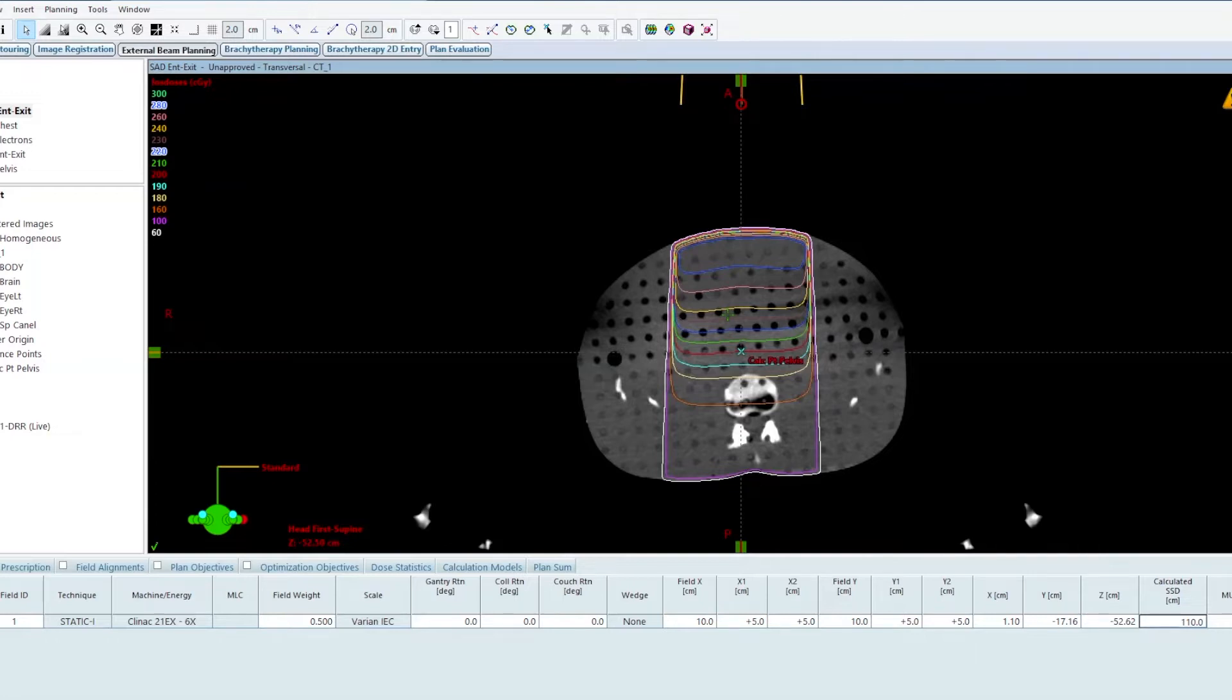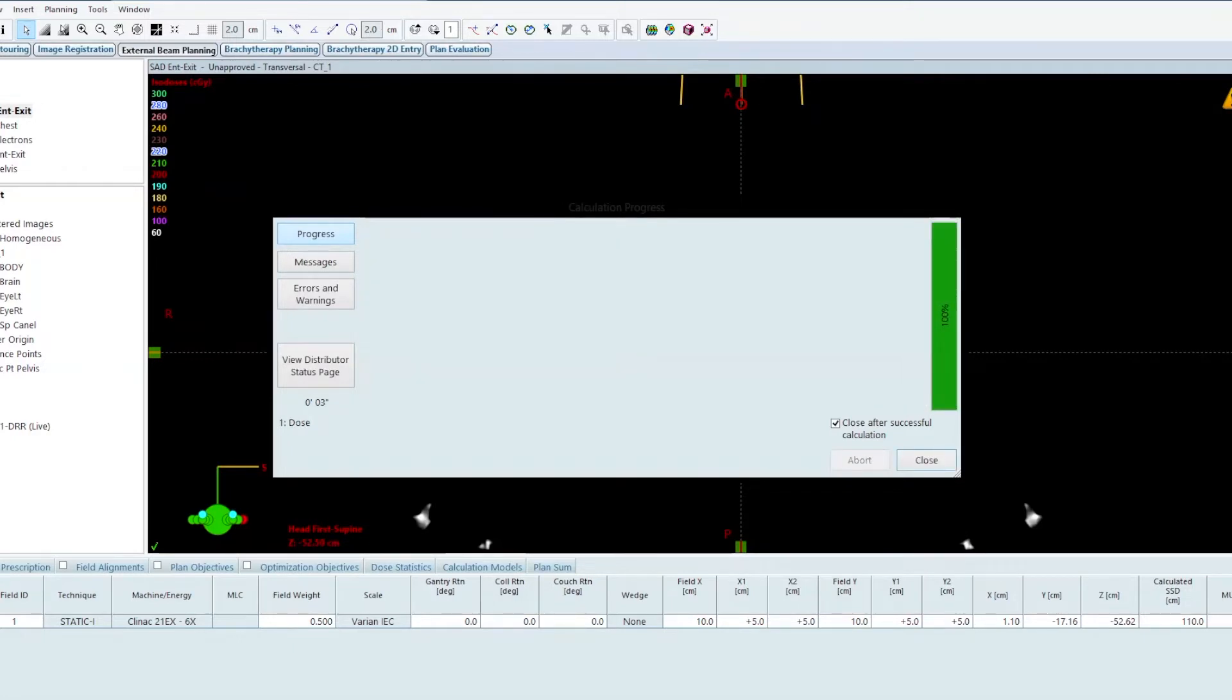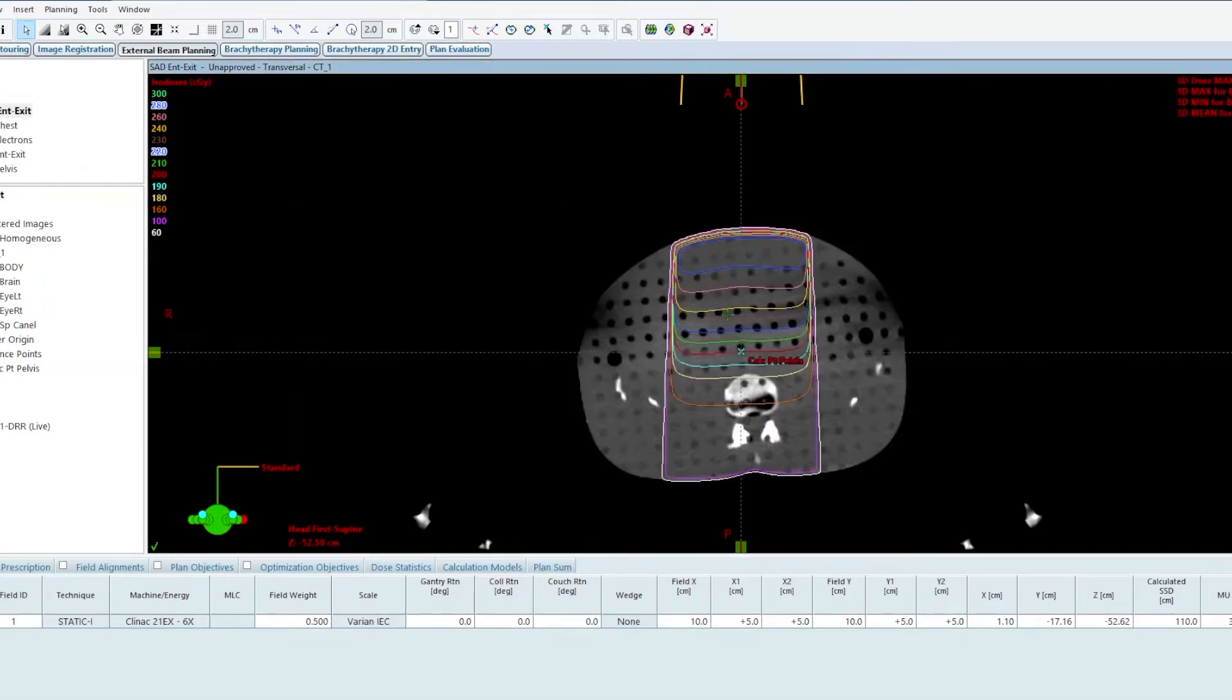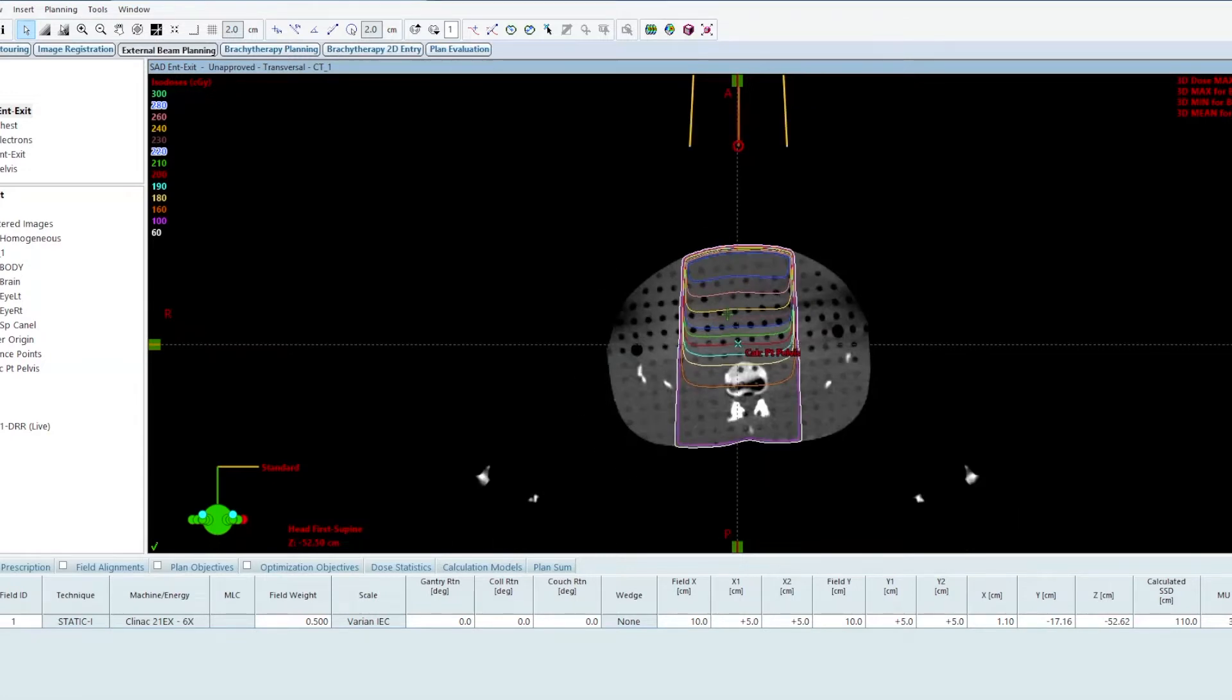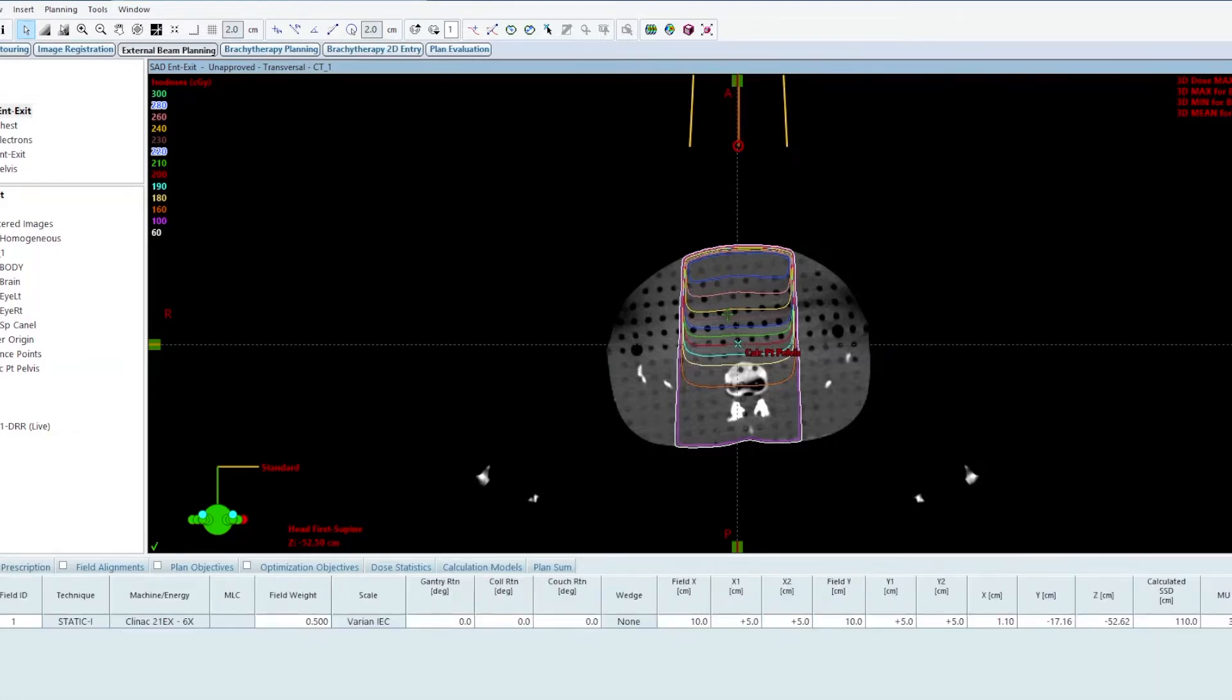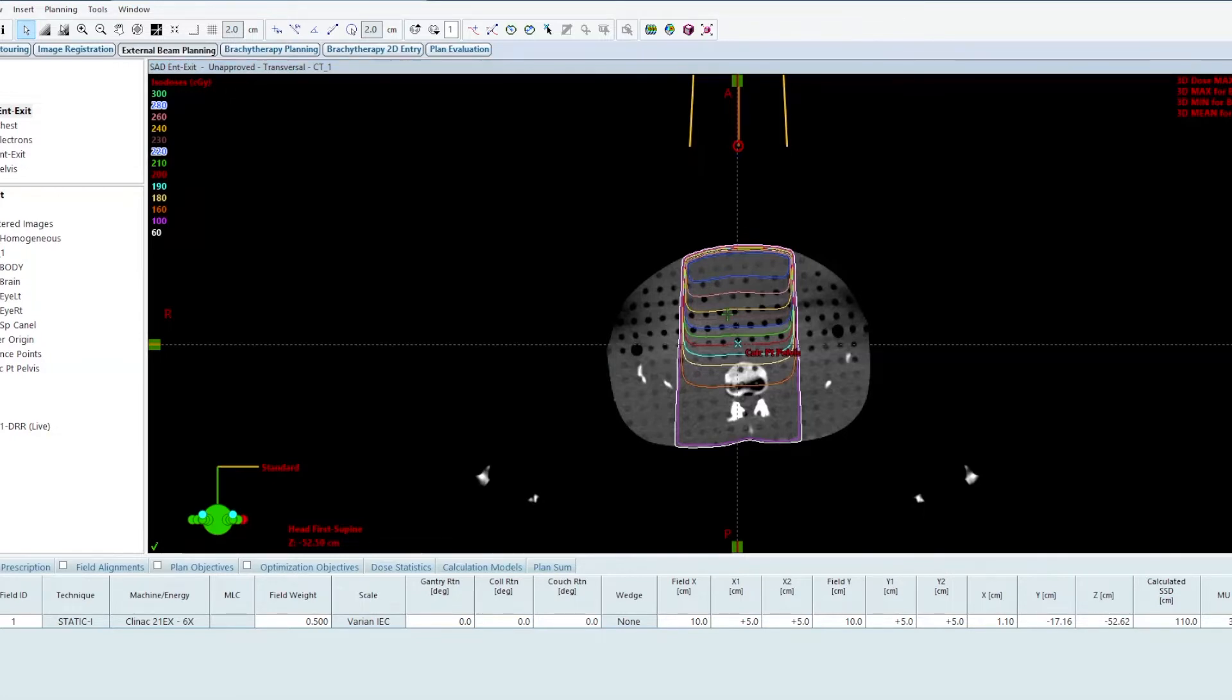I'm going to recalculate the dose on the treatment planning system. Let's go through the dose calculation for this. I have 358 monitor units, 10 by 10 field size. I'm delivering 200 centigray to the calculation point. My attenuation is 10 centimeters, so I have 10 centimeter depth. My calc point now is an extended distance away from isocenter and the calibration point for the machine.